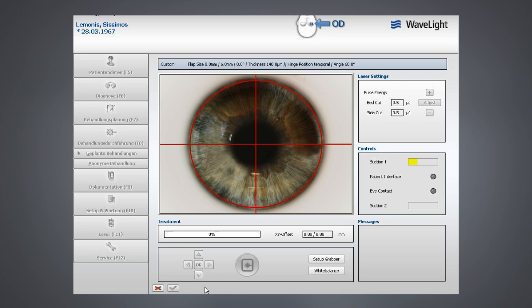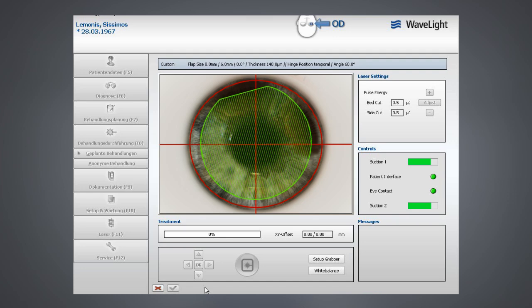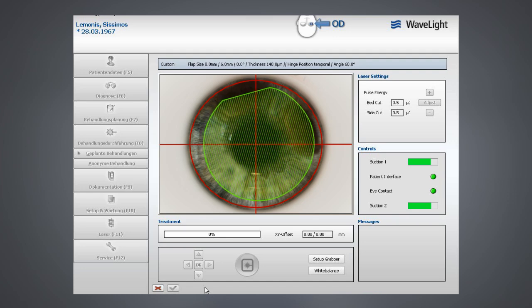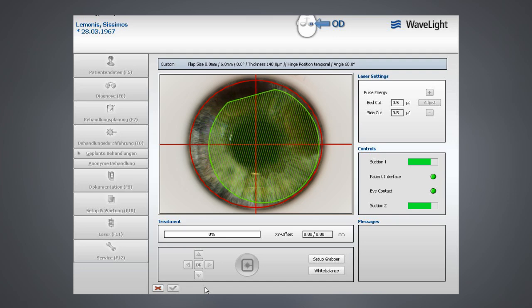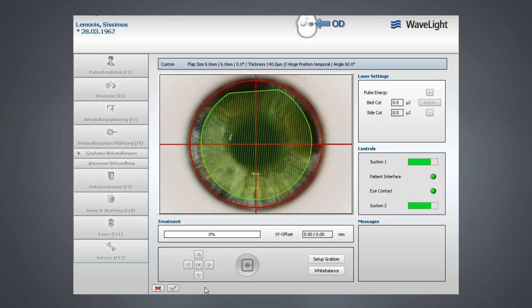The WaveFlight FS200 femtosecond laser offers the physician the unmatched ability to adjust the placement of the flap even after the suction ring has been applied. By shifting the placement grid before the flap is created, the physician may customize flap placement to best fit the ablation profile of their patient.